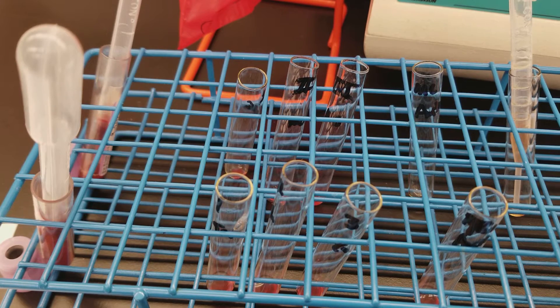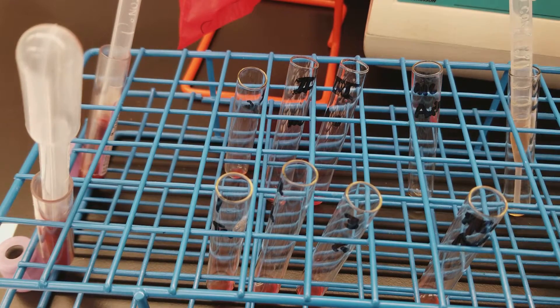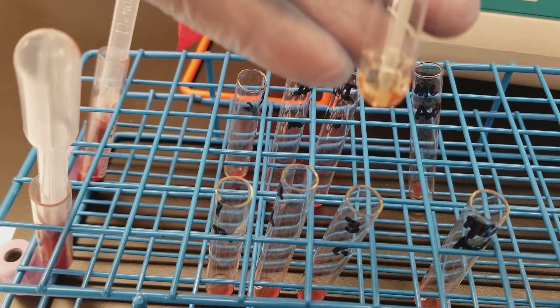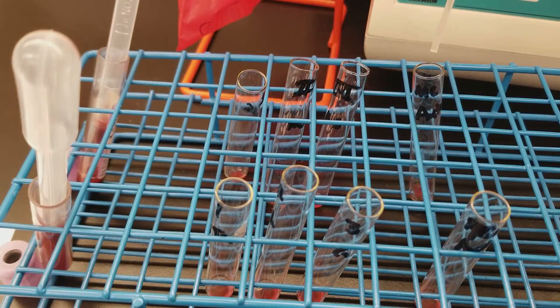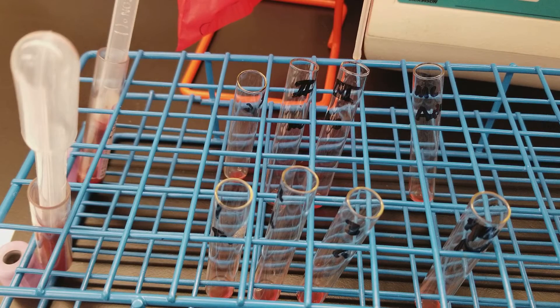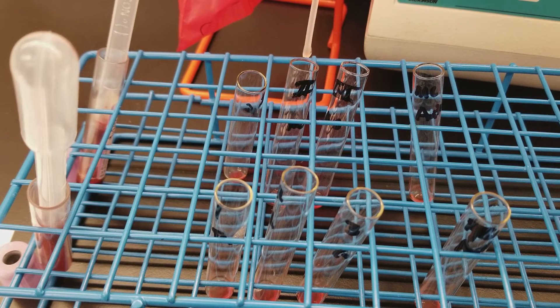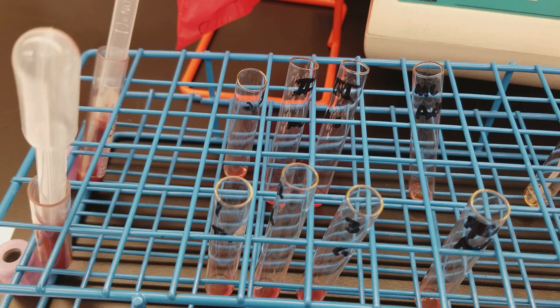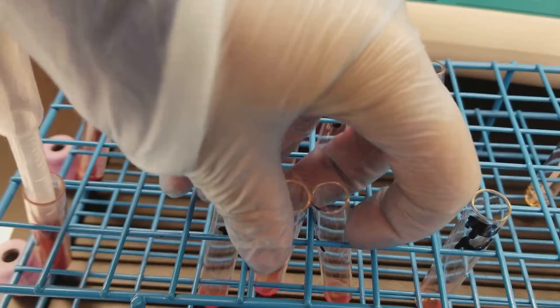I'm going to do the same now for the second patient: one drop of patient cells and two drops of plasma. Now I'm going to centrifuge them for 15 seconds each.